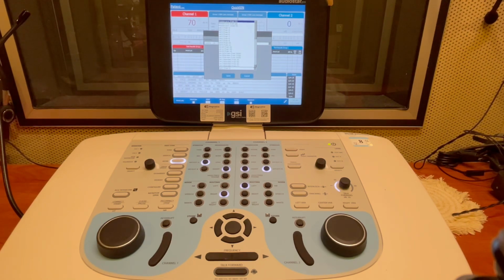The practice lists do not score, so if you accidentally start with the practice list, you're going to be doing 3 lists on one ear. So we're going to set it up with the right ear as channel 1. We're going to do list 1, track 3. Our source is internal. The CD name is QuickSIN, word list 1.